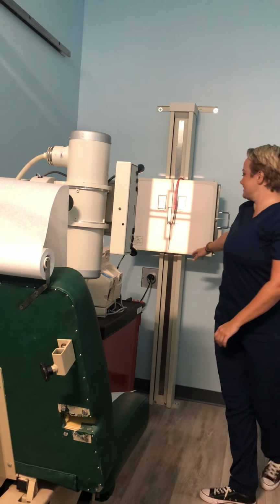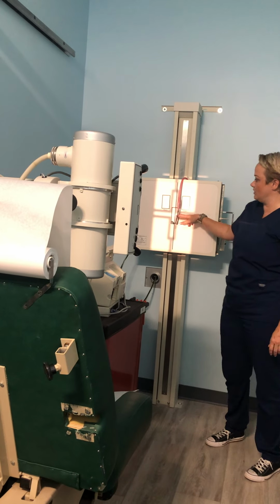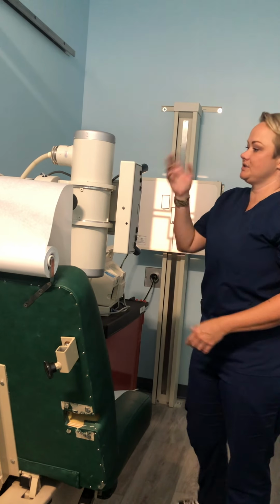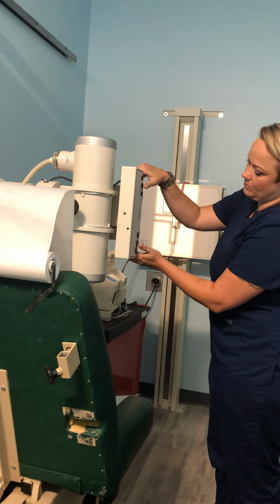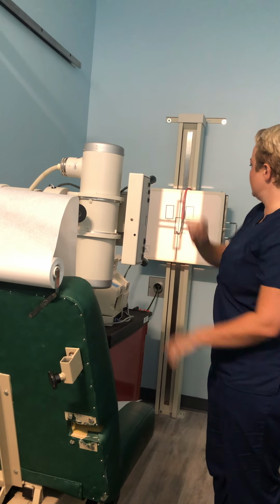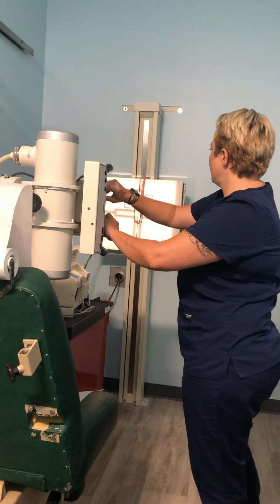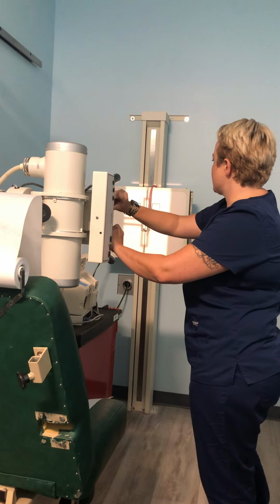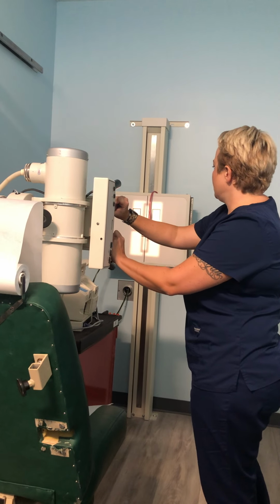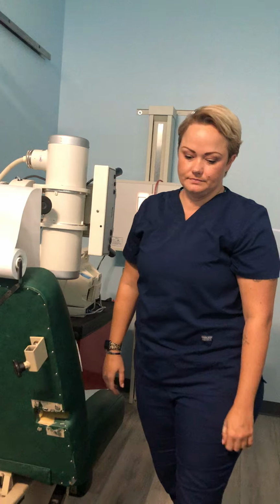And you can kind of see that the crosshairs are not centered on the wall. That is an issue with this unit, but what we'll do is pop him out a little bit so he's right on target right there. So the less light that you have, the less exposure to the patient, so if you don't need it, bring it on in. All right.